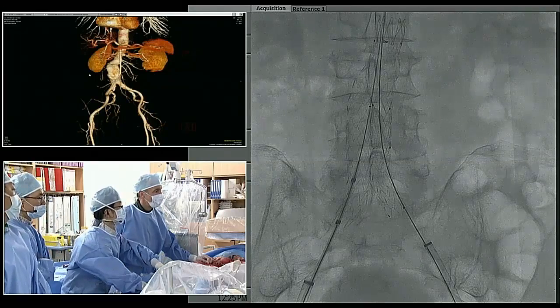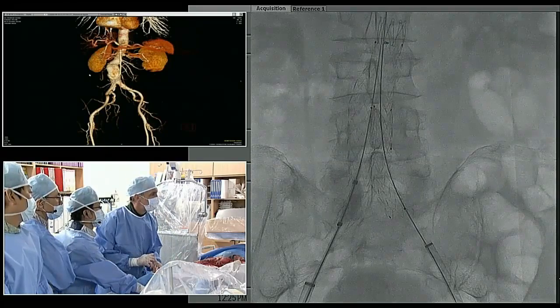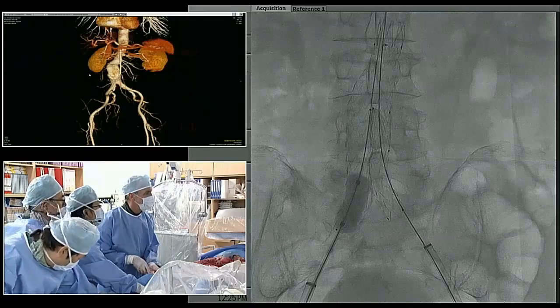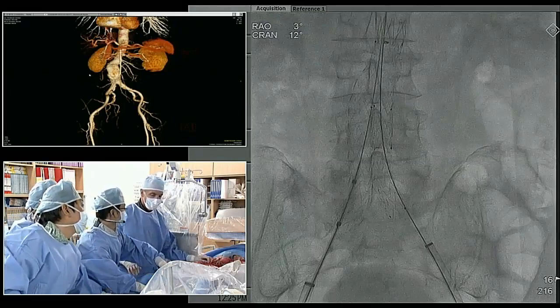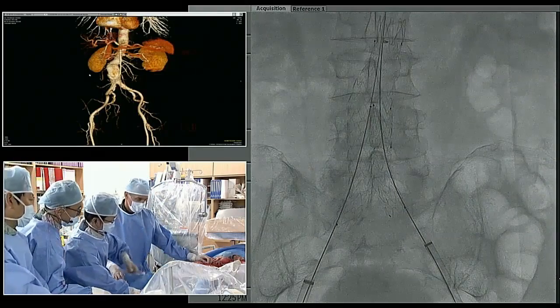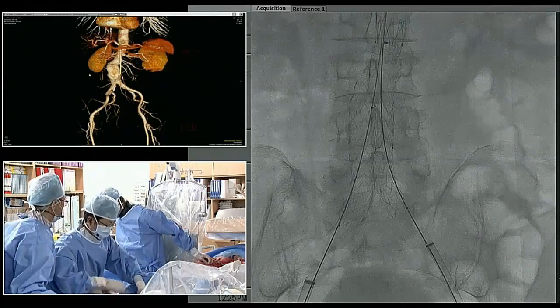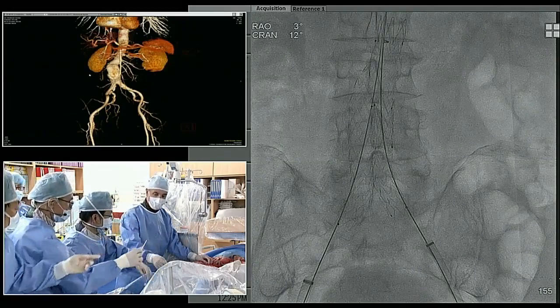Go ahead. Well, that's very true. Yeah, he's staying inside the graft edges. And all he needs is a light tap. It doesn't have to be that strong. There you go. That's good. Okay. Yep. We'll go on the other side. Okay, now he'll do the other side with the overlap junction out into the internal iliac. It's okay. It's good.